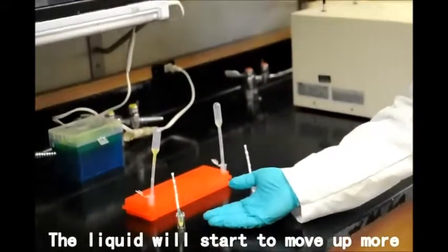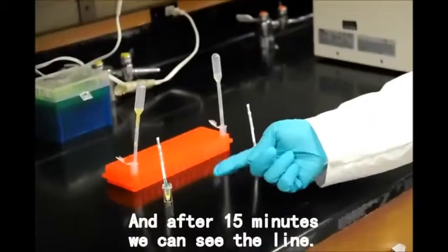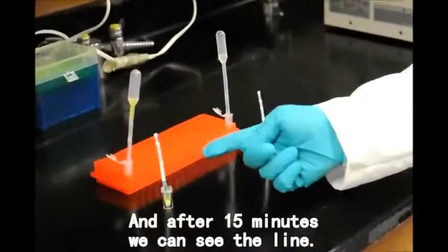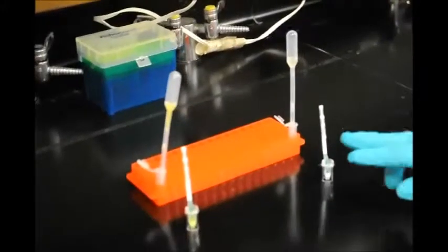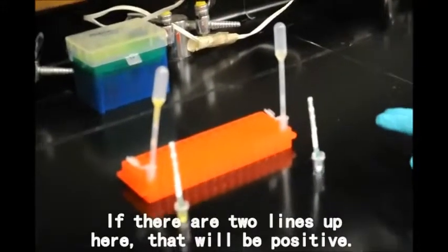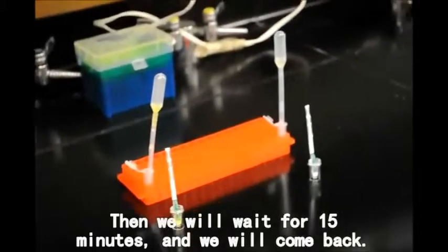The liquid will start to move upward. After 15 minutes, we can see the lines. If there is one line, that is negative. If two lines appear, that will be positive. We'll wait 15 minutes, then come back.